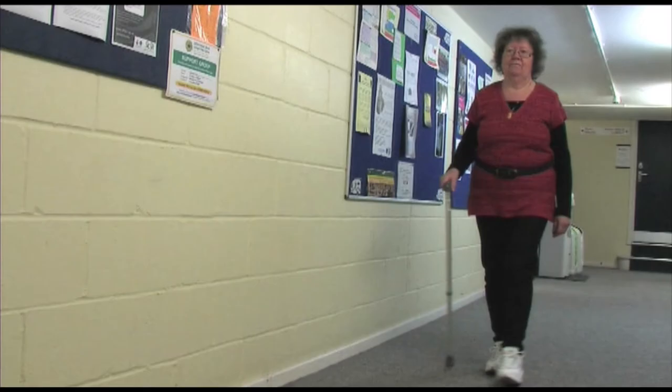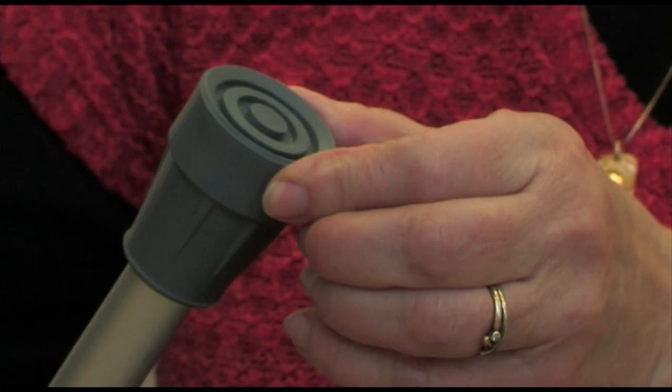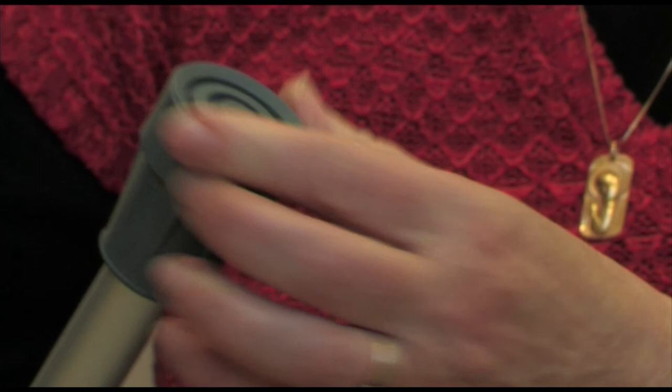Follow the supplier's instructions for adjusting and maintaining the stick. Once the height is set, walk normally with the stick at your side. Check your stick regularly, especially for wear on the rubber foot known as the ferrule, and replace this as necessary.